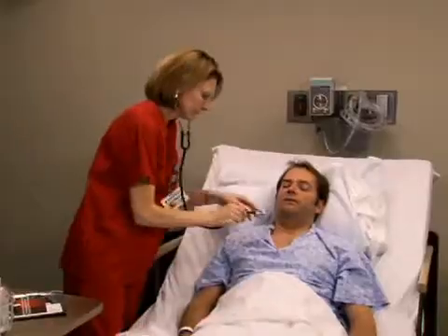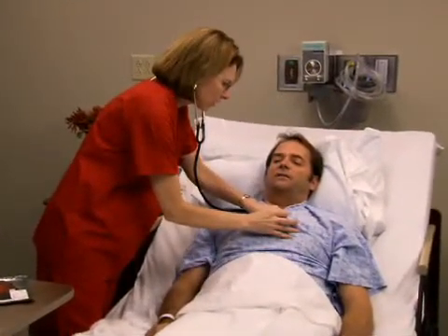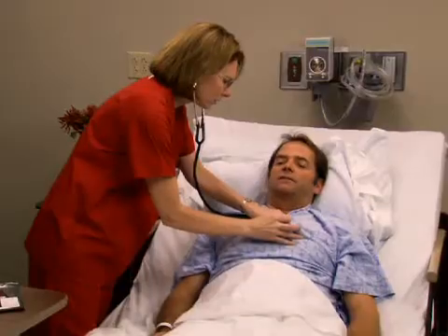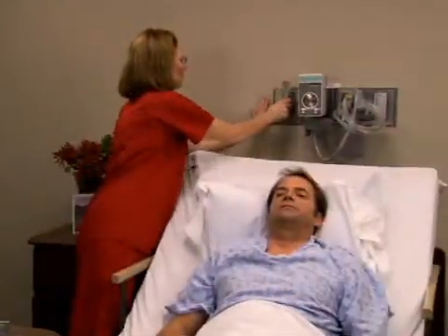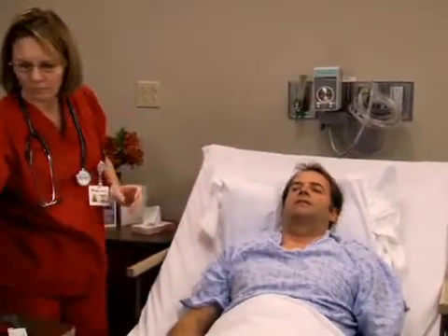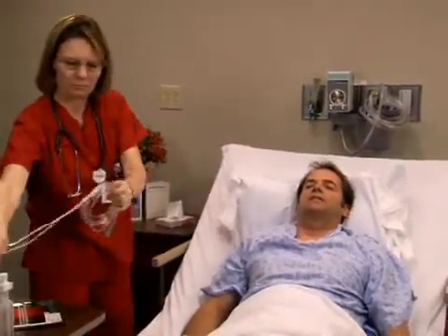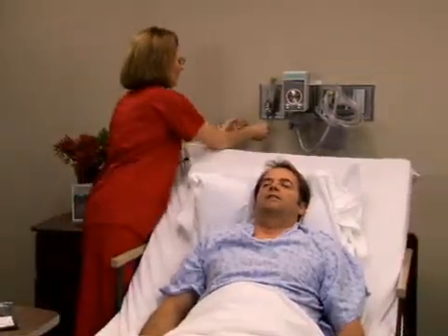Before setting any oxygen flow rate, assess the patient's respiratory system and consider the prescribed oxygen delivery method, flow rate, and duration of therapy. After attaching a flow meter to the oxygen source, attach the oxygen tubing to the delivery device and the flow meter. Then adjust the flow rate as prescribed and check to ensure that the oxygen is flowing.